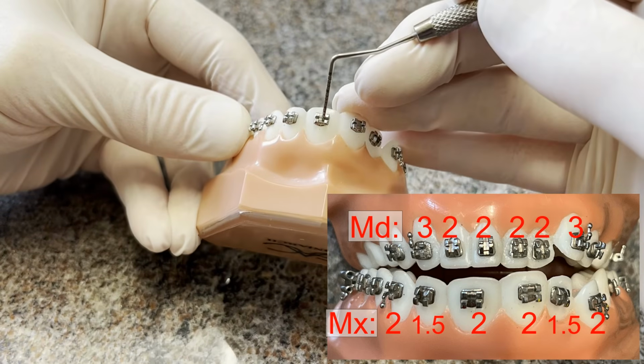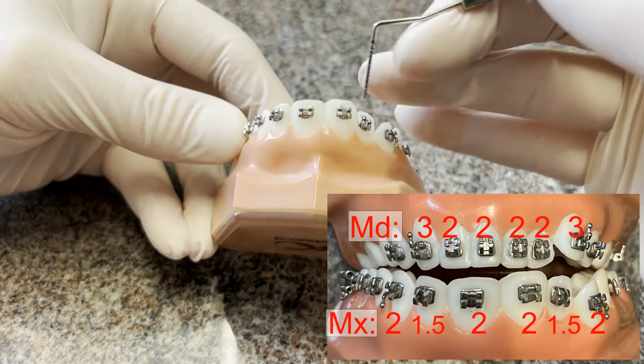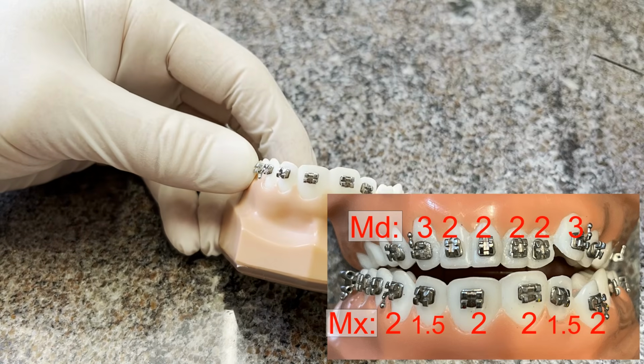And then you make sure you push it into place, make sure all your flash is cleaned up, and then you go on. And you just do that for all the 3 to 3, and then the doctor will come and check.